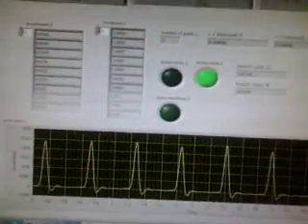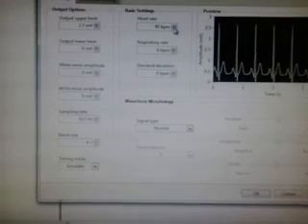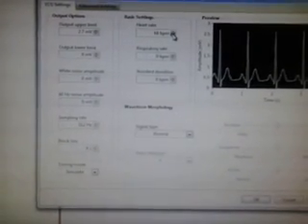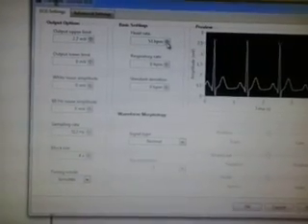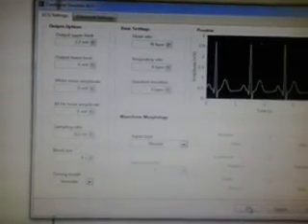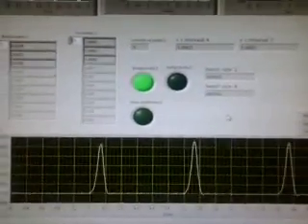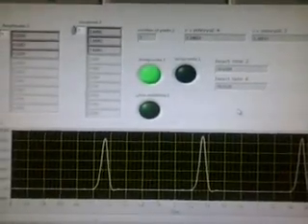And now if we see the simulator and take the value of the heart rate below 60, that is around 50, okay, 50. Now run the server block diagram, then we get the signal to be bradycardia. That is, the simulated ECG signal that is obtained to the program is bradycardia.